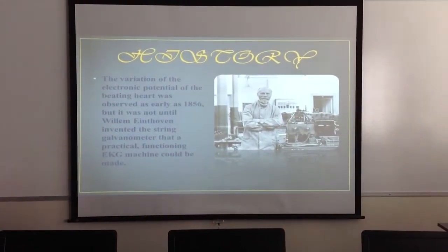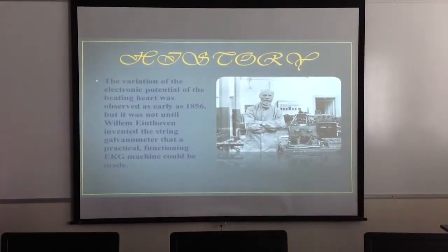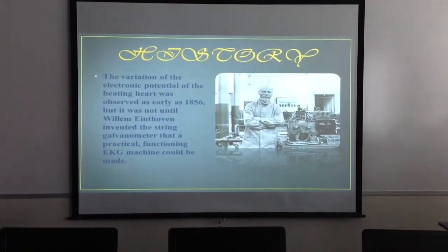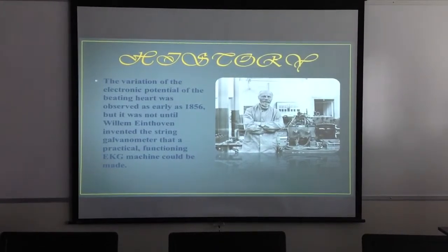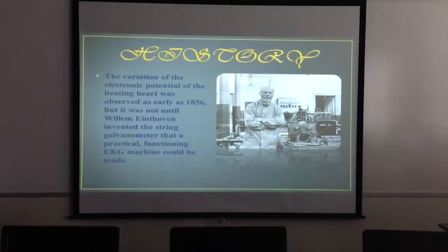The variation of the electric potential of the beating heart was observed as early as 1856, but it was not until William Einthoven, who invented the string galvanometer, that a practical functioning EKG machine could be made.